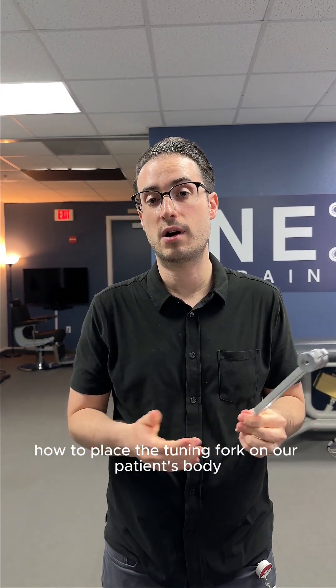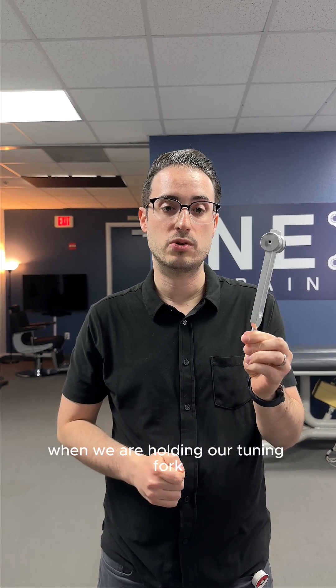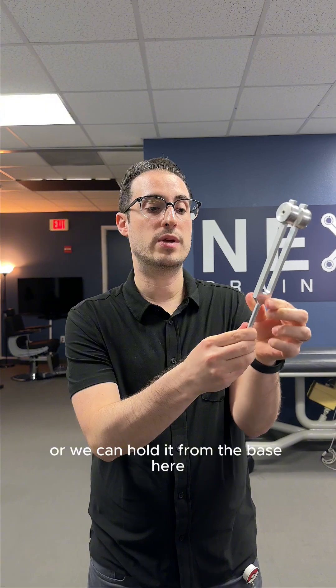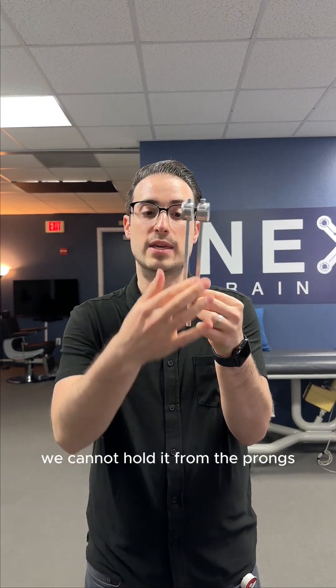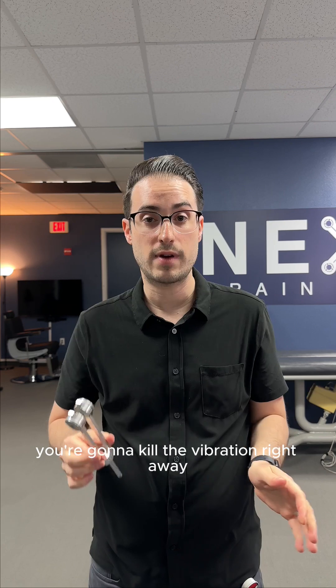We need to know how to place the tuning fork on our patient's body appropriately. When holding the tuning fork, we hold it from two places: from the handle or from the base. We cannot hold it from the prongs — if you hold it from the prongs, you're going to kill the vibration right away.